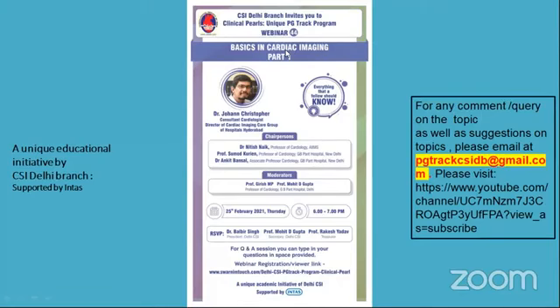So here it is a conditional kind of assessment, wherein, as you know, most of the devices today are MR compatible. So we take in these patients provided they are in the VOO mode. We have the EP person and the company person coming and programming them.